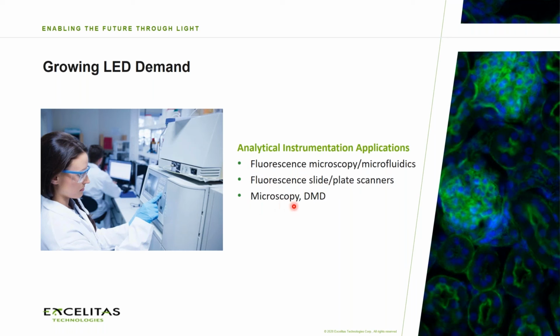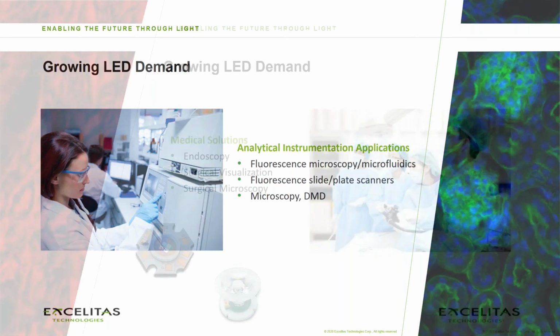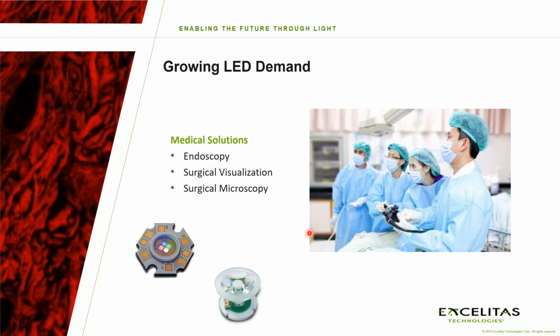It's not only limited to analytical and microscopy applications, it also extends over to endoscopy, surgical visualization, and surgical microscopy. And along with your white light that a surgeon uses in this device over here that he's holding, along with white light to go into a body cavity, they also want to excite fluorescence now. So that's either UV or it's infrared, but there's also a fluorescence angle to endoscopy.